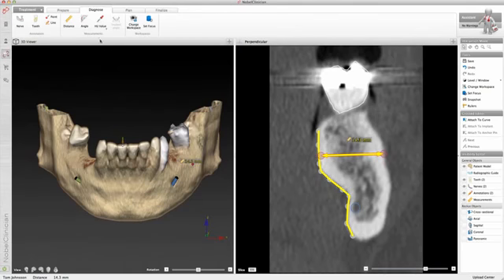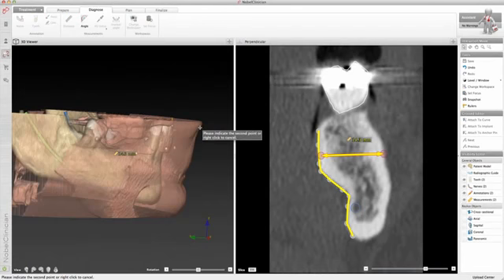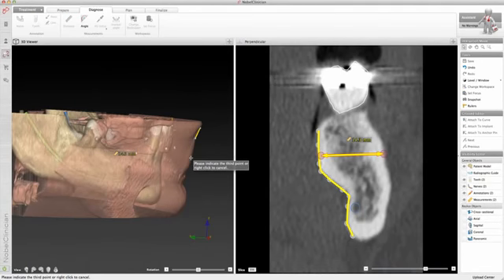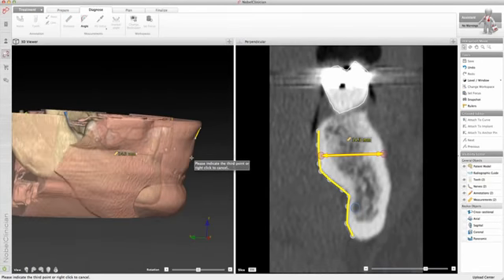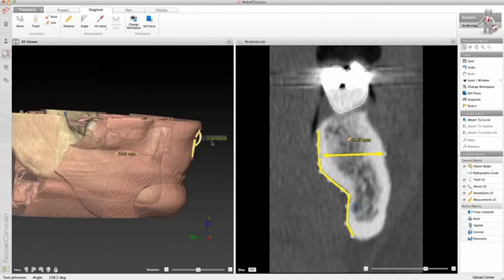The angle tool measures a 3D angle. Just indicate three points. This measurement can be adjusted by moving the points, and the angle will automatically be updated. The 3D angle is displayed next to the measurements and also at the bottom left corner of the screen.